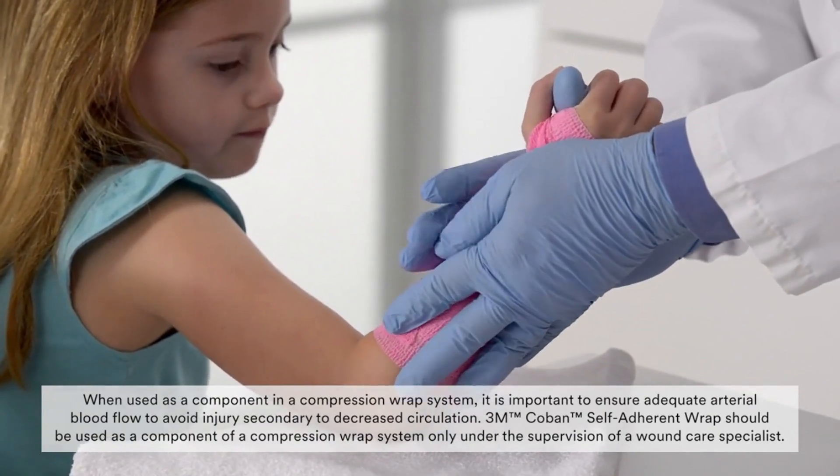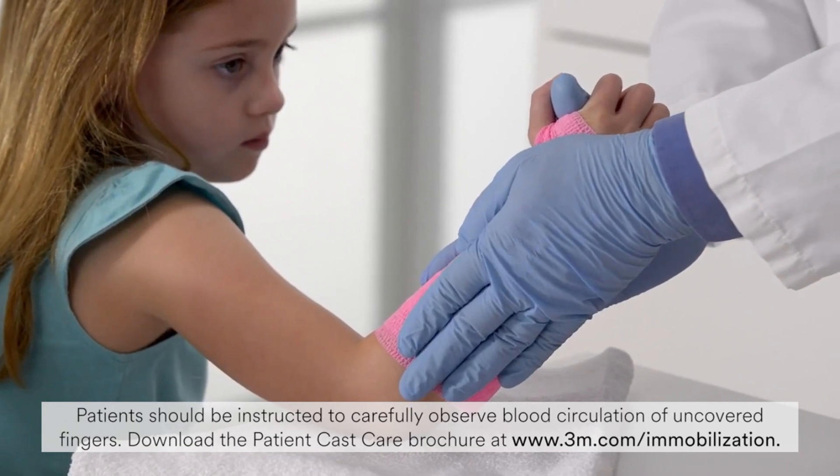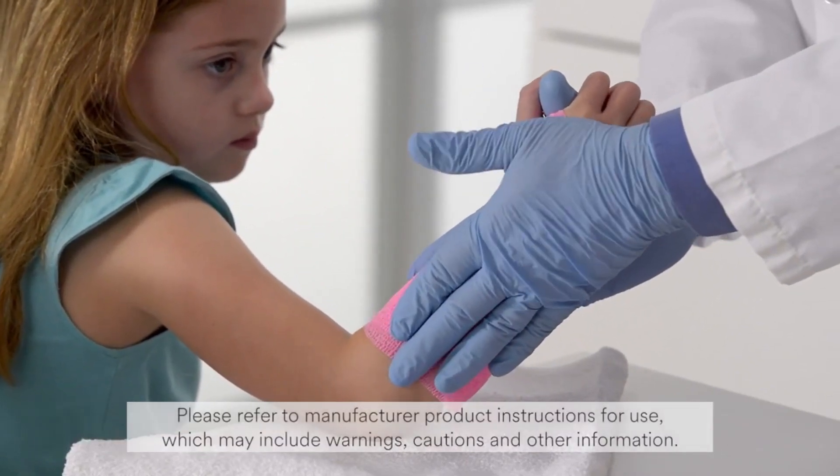Keep the arm still for three to four minutes to ensure the splint sets. The splint will be fully cured within 20 minutes.